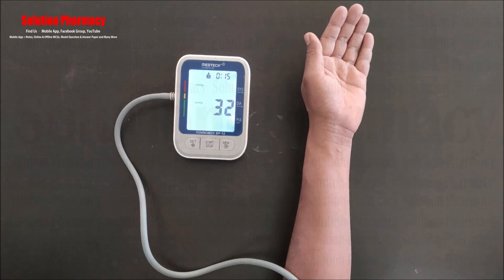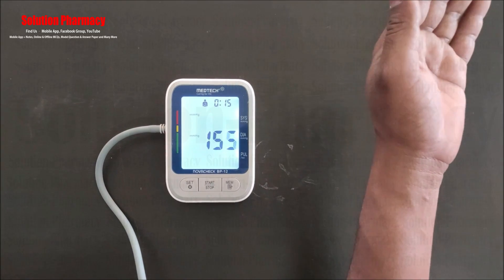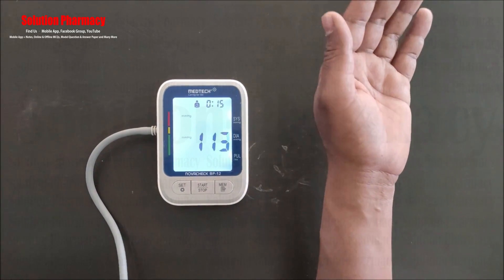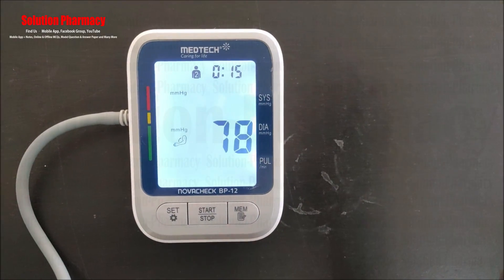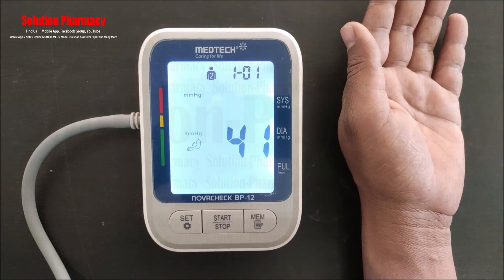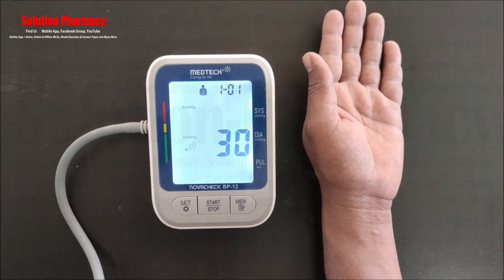This BP monitor has one extra feature — an arm movement indicator. This indicator appears on screen when the person moves their arm during measurement, reminding the user to keep the arm in a steady state for an accurate reading. This is how we measure blood pressure using the Medtech BP monitor. Thank you very much for watching this video.